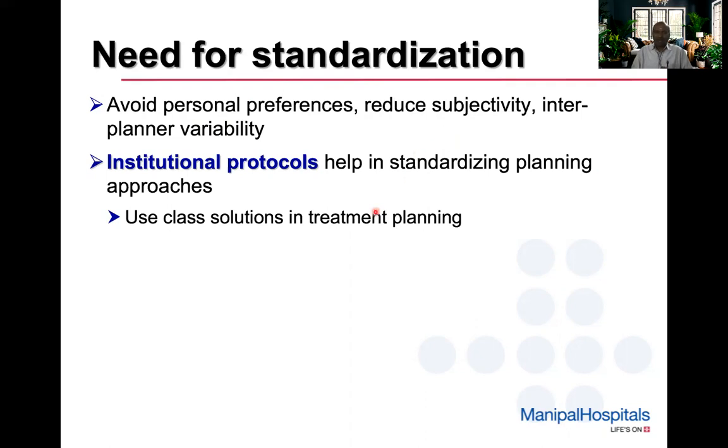How do we achieve that? Define institutional protocols that can help in standardizing the planning approaches, how we do planning for different patients and different sites in the standard way. Develop institutional protocols and try to use class solutions in treatment planning.